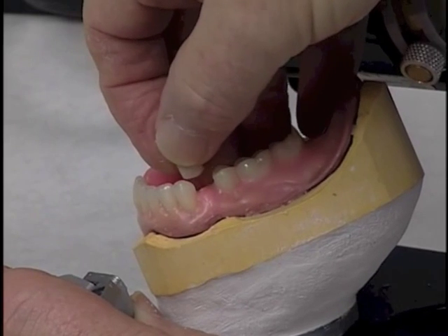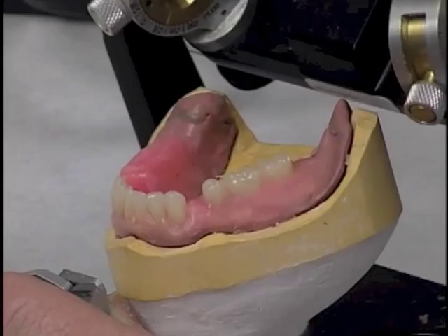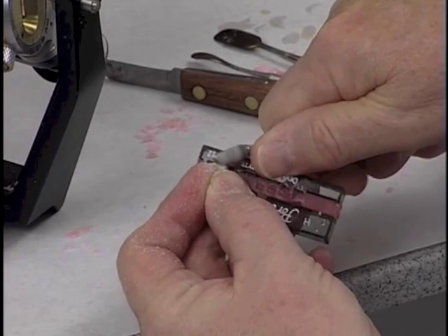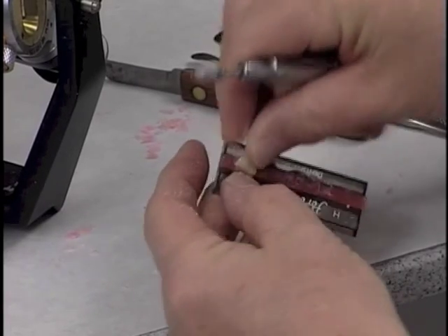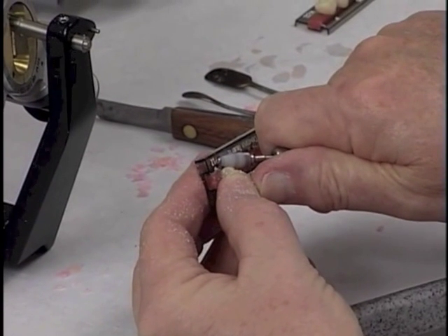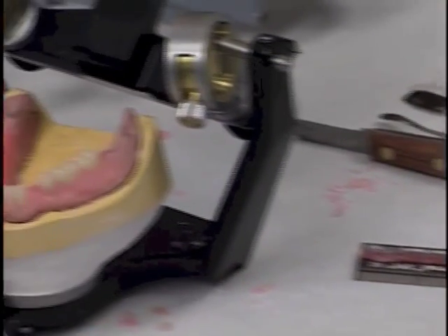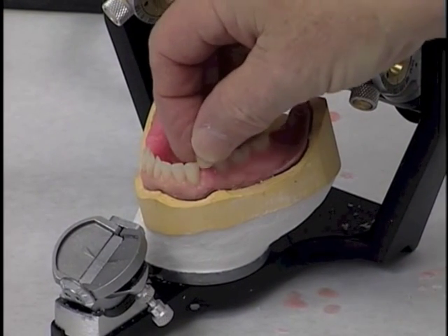And we see when we try that onto that area, it's a little bit too wide mesiodistally. So what I'm going to do is trim that tooth on the proximals of it. We'll grind some on the mesial, and then we'll turn it over and grind some on the distal of it. And now we'll try it into the space once again and see if that looks like the correct space for us.